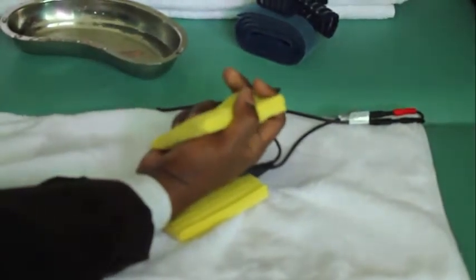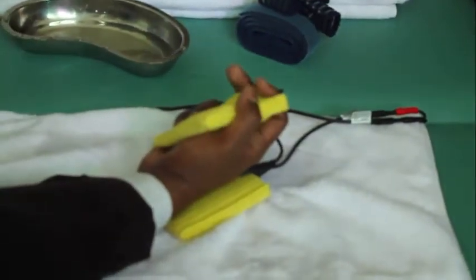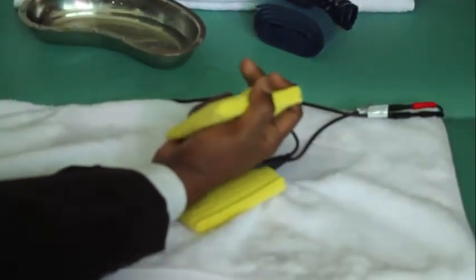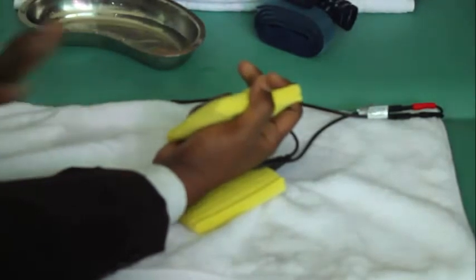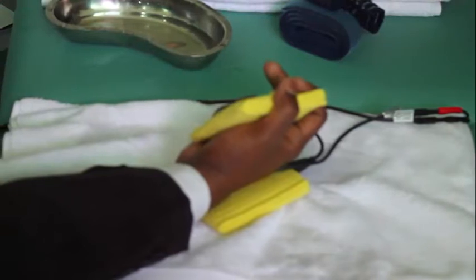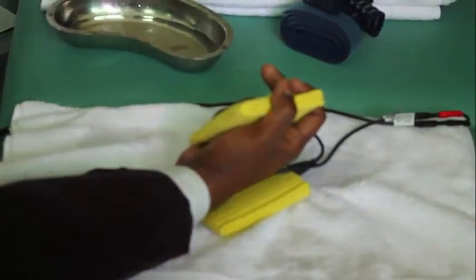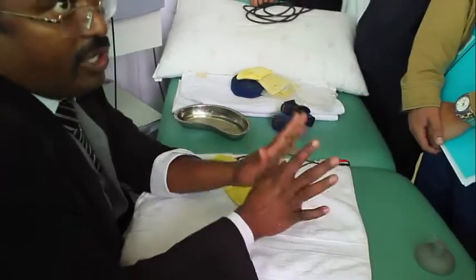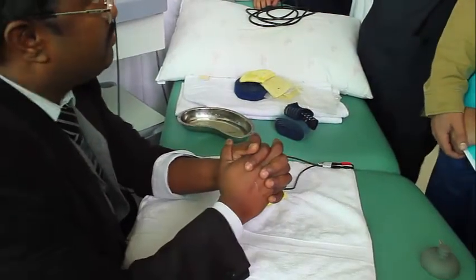You will, 1 minute. Once I finish, everybody is going to do it. This is self-testing, whether current is coming to me or not, whether the machine is proper or not. So decrease. By this I came to know the machine is working, quite no problem. So then I can apply it to the patient. If I am sure, then I can apply it to the patient.